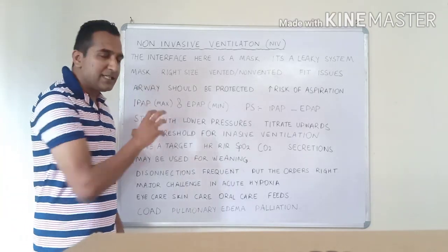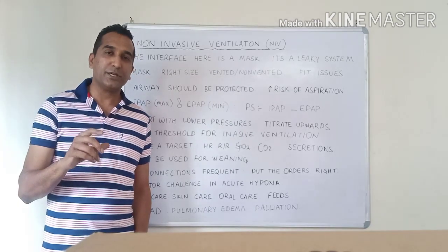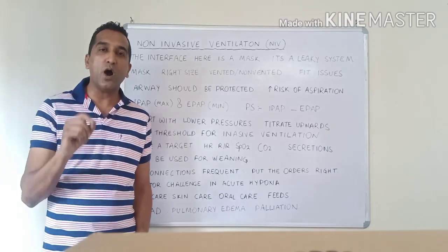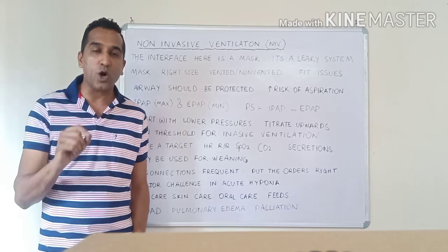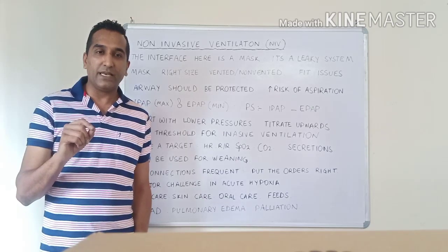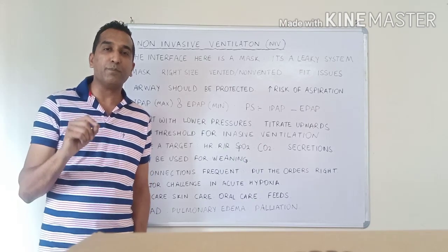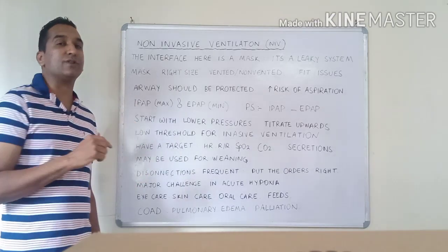The success of the NIV system depends on the choice of the patient, but is tremendously dependent on the support staff or how well the monitoring has been done, because things can go wrong on an NIV. And the monitoring in the first few hours of therapy is very, very important, especially the response as well as the condition of the airways.